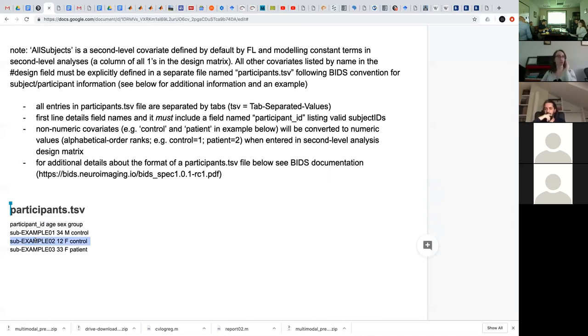I don't know if this is exactly what you're getting at, but I can imagine we're in a meeting, somebody's run a ton of different kinds of analyses, and then someone makes a great suggestion of, well, just drop that subject. How easy is it to do that? To just drop a subject, just rerun the second level without that subject?